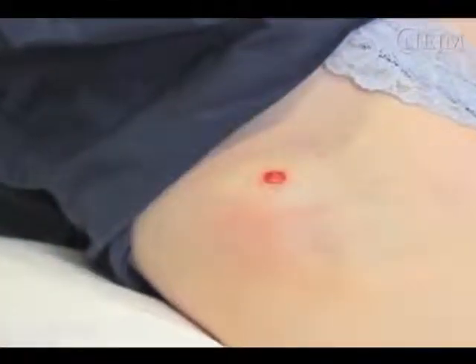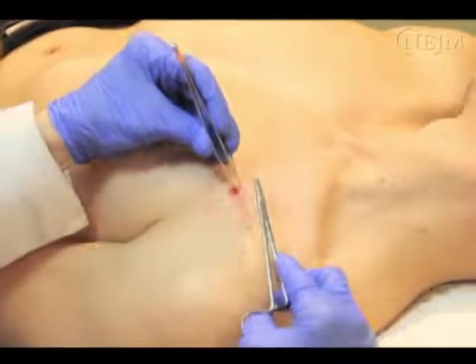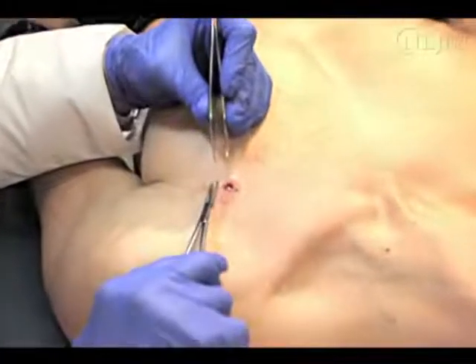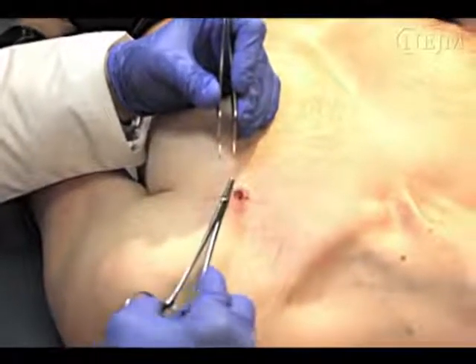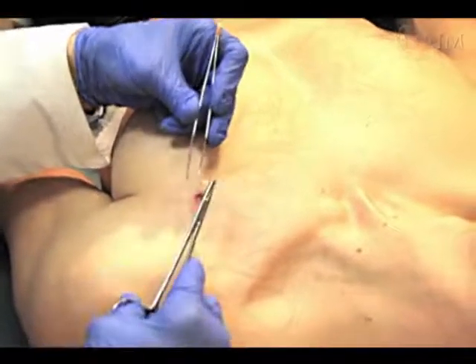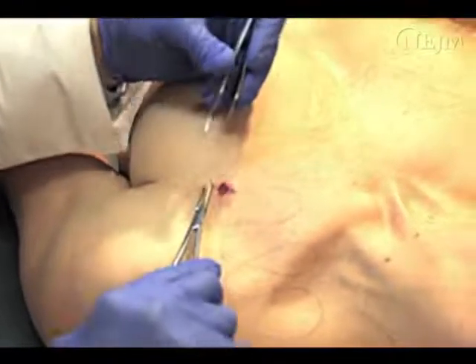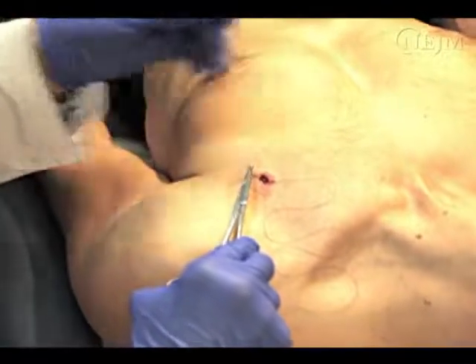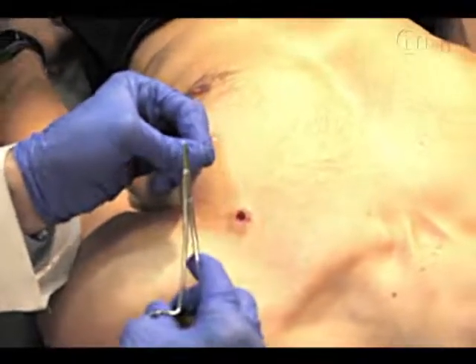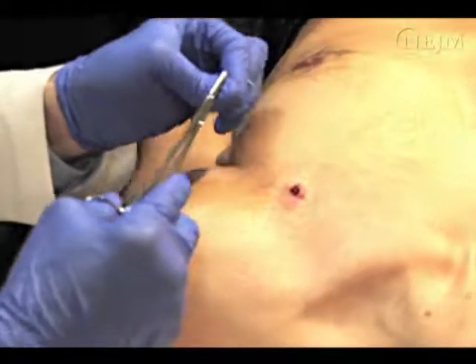When you have finished the biopsy and obtained the specimen, you may suture the wound. Place the sutures perpendicular to the long axis of the punch defect and perpendicular to the skin tension lines. Begin by placing the needle through the edge of the wound. Release the needle and, keeping your palm down, grasp the point with the needle driver. The wrist curves naturally, directing the blunt end of the needle to your forceps. Reload the needle driver, then pierce the opposite edge of the wound with the suture. When it emerges from the skin, grab the point with your palm down. Circle the suture around the needle driver twice, then rest the driver on your thumbnail to prevent the suture from slipping. Pull up on the thread until the free end of the suture is short and secure it with the needle driver.